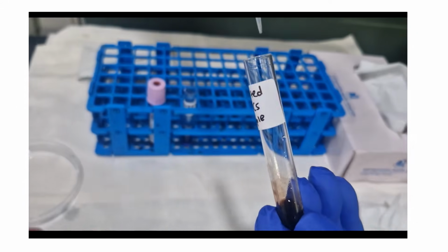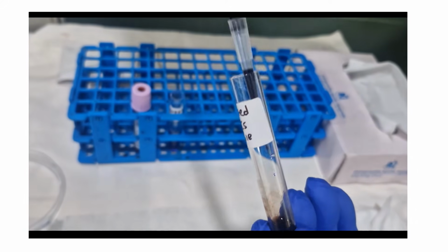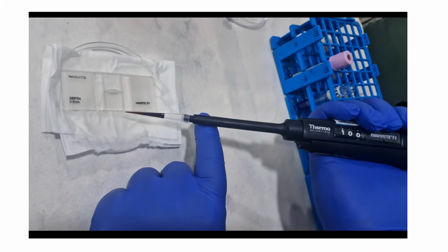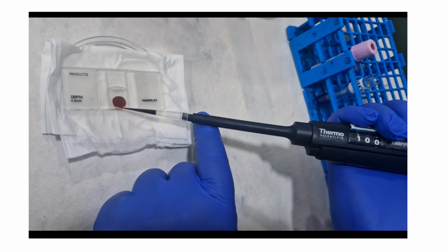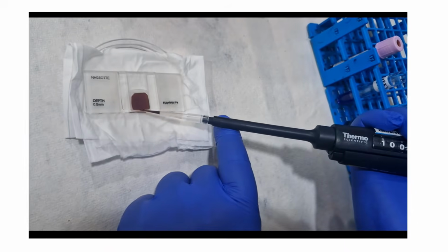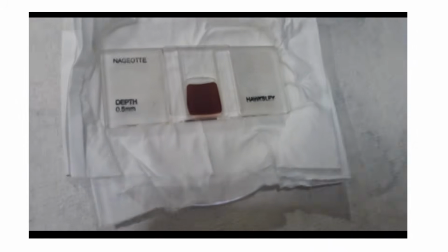Then carefully load the diluted sample into the Nageotte's chamber, ensuring that the chamber is completely filled. We will place the loaded chamber in a moist environment for about 15 minutes to allow the leucocytes to settle on the grid.